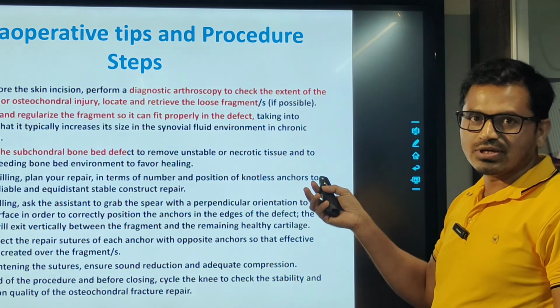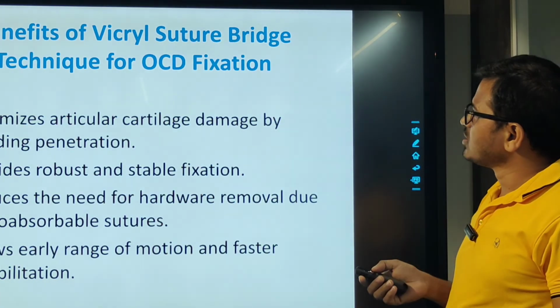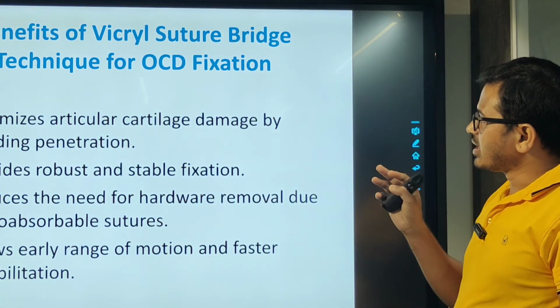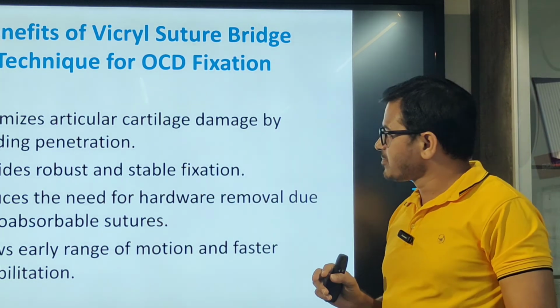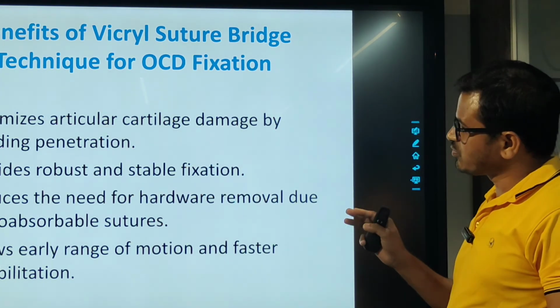So these are the steps we have already discussed in the video. So what are the benefits of the vicryl suture bridge technique for OCD fixation? So we can see it minimizes the articular cartilage damage by avoiding penetration. Second, it provides robust and stable fixation. And it reduces the need for hardware removal due to bioabsorbable sutures.